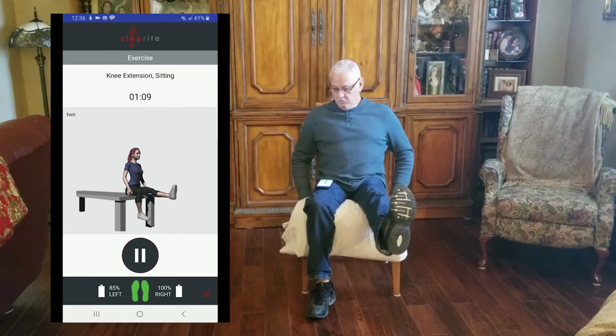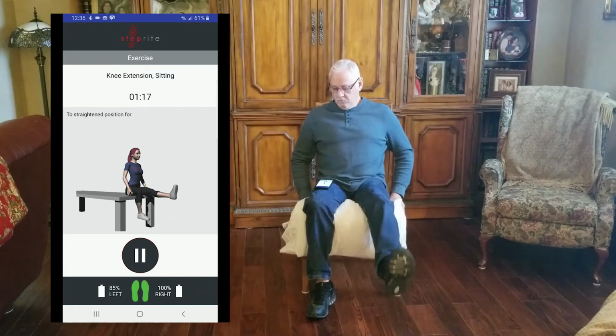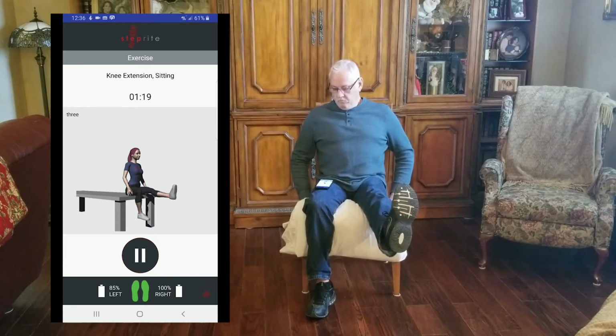Once these exercises are complete, you would be asked to hit the continue button to do the exercises on the right leg. Once the right leg is completed, then that exercise is done and you're ready to move on to the next exercise.